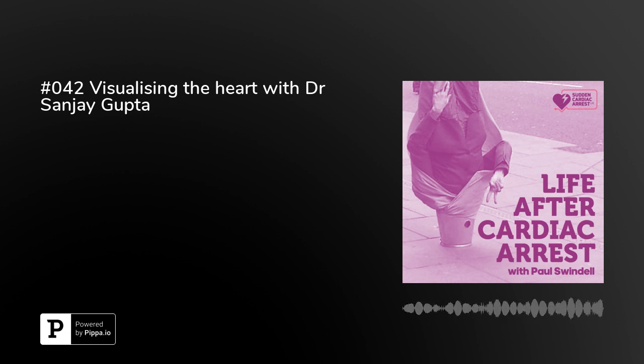It didn't really give you the diagnosis. It just told you that the heart had changed this way based on the electricity through the heart muscle. With the echo, you're actually visualizing the heart. So a far better way, you can actually measure the thickness of the heart, and you can look at the valves, etc. So yeah, in the old days, we didn't really have very much at all to determine what was going on.